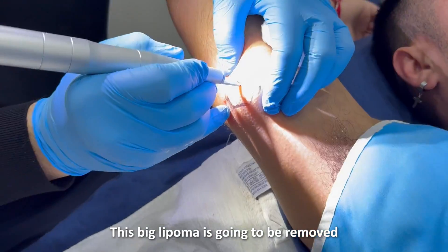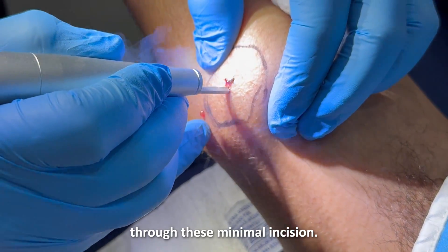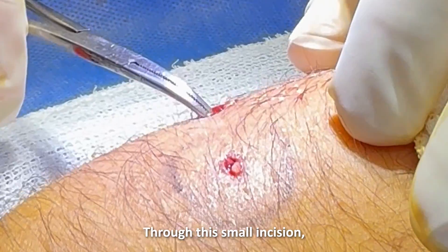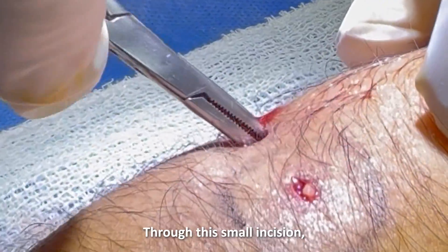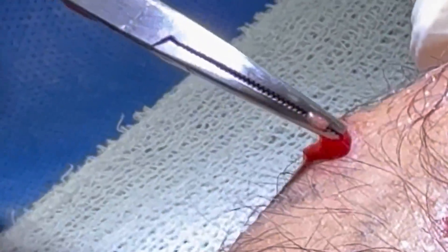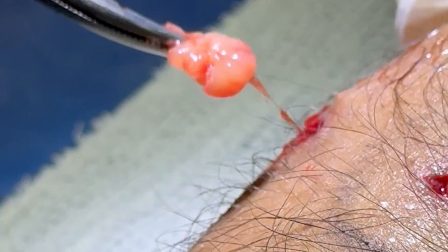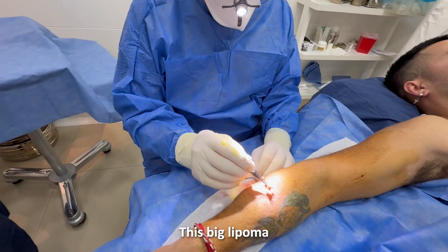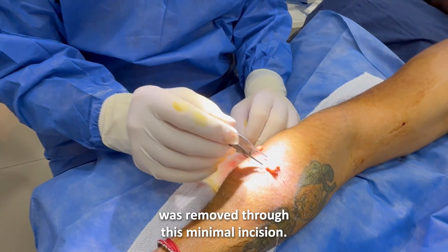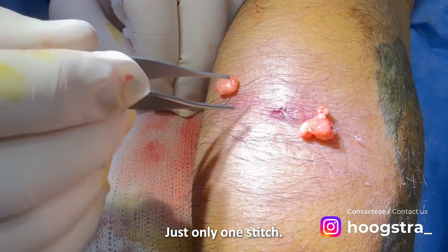This big lipoma is going to be removed through this minimal incision. Through this small incision, we are removing the lipomas. No damage of the tissue. This big lipoma was removed through this minimal incision, just only one stitch.